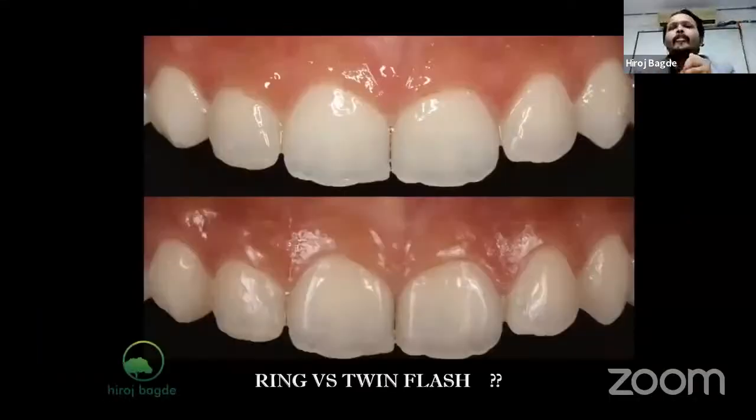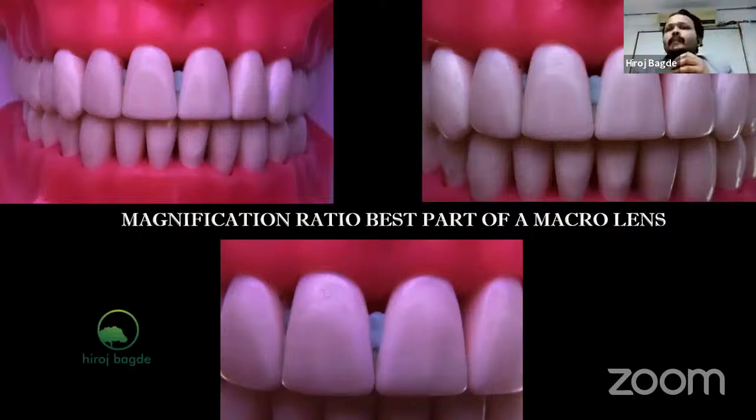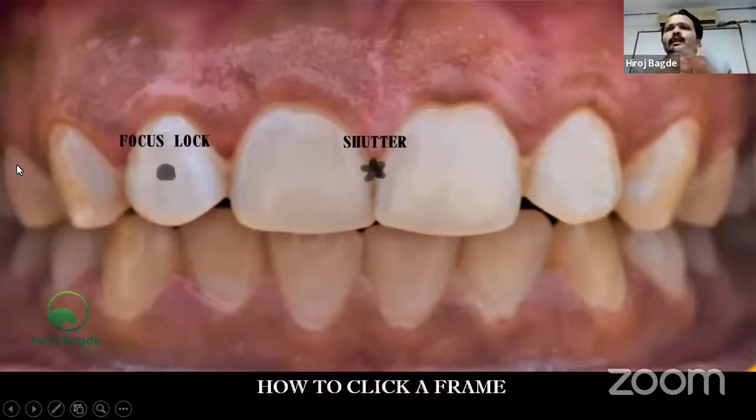Can you see this? How to click a frame? My shutter will be seen in the center of the star. Whenever I see this image, it will be the center. But when my lock is there, can you see the lateral incisor? I'm having a focus lock on that particular aspect. Why? Because if I don't lock my focus here, my focus will be lost on the posterior aspect. If I lock my focus here, everything behind it will be blurred with the same f-stop.